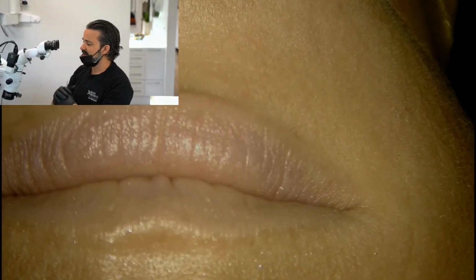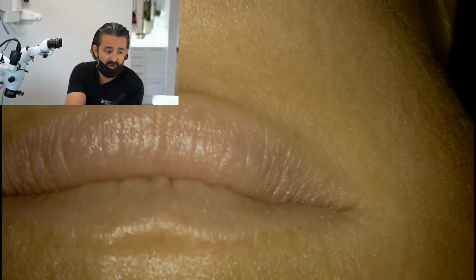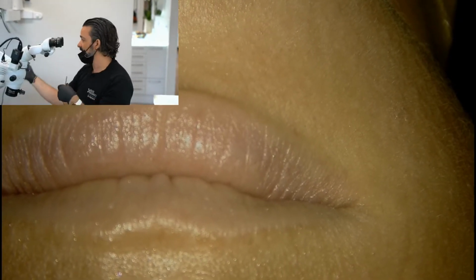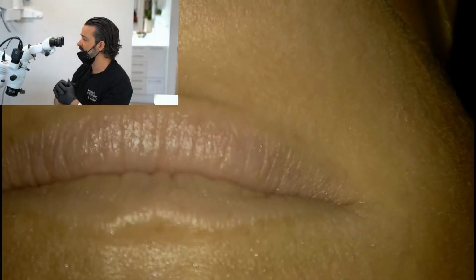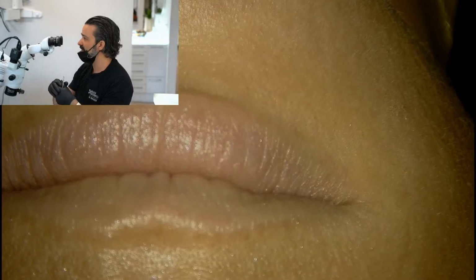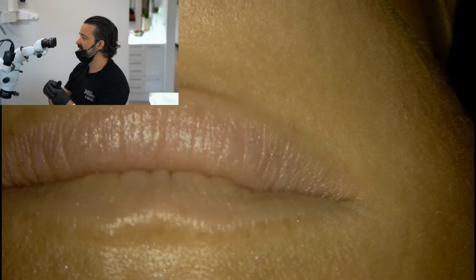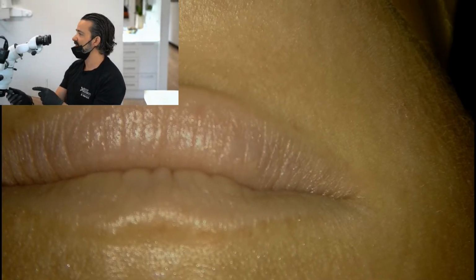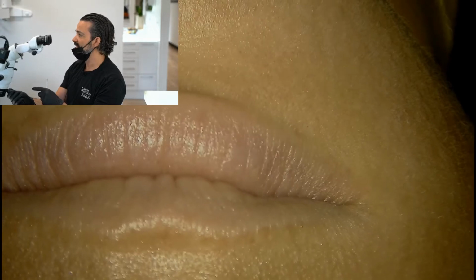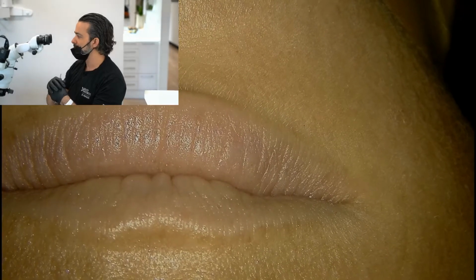And so on a microscope, that image is always that image, even when I'm looking around or I'm talking to my assistant or to an escort in the room, a companion from the patient, maybe it's a patient's mom or something. And if I'm doing video documentation or image capturing, or I'm wanting something to explain to mom or dad, it's really nice having this in a static position.